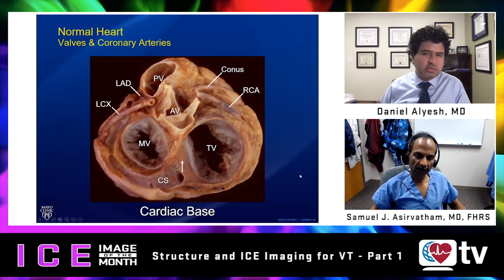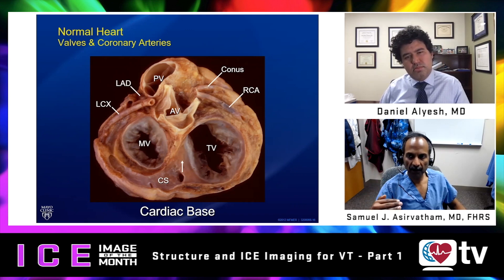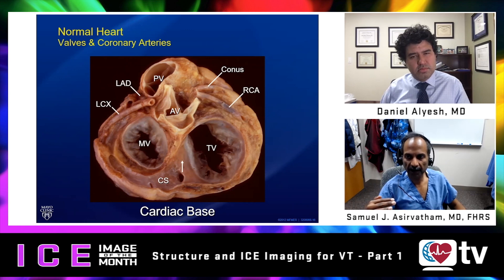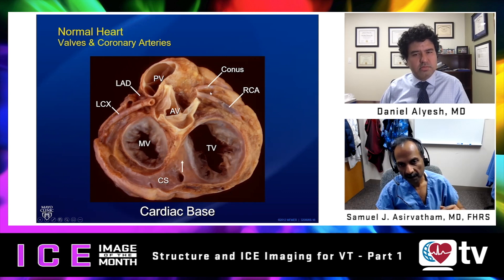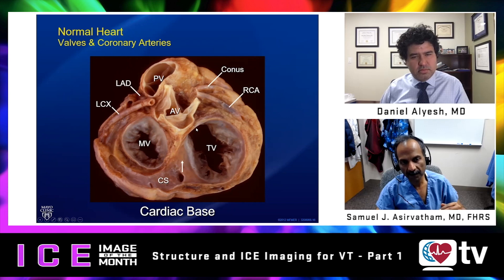One of the most difficult areas to understand — and where ICE can be of great value — is the cross-sectional relationship of juxtaposed structures at the level of the base of the heart. The key visualization piece, whether looking from the tricuspid valve, the bundle of His region, or the ICE probe in the pulmonary outflow looking down at the aortic valve, is to recognize the aortic valve and label the sinuses of Valsalva, then anticipate what structure lies next door.